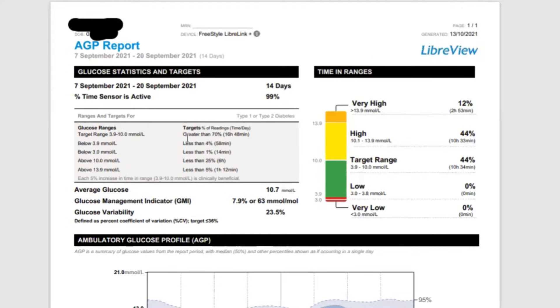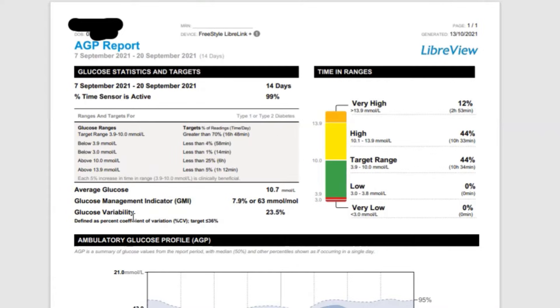We want to be in the target range 70% of the time or more. You can also see the targets for low blood sugars — below 70 mg/dL — and urgent low, which is 3 mmol/L equivalent to 55 mg/dL. Next, we look at the average glucose: 10.7 mmol/L, which is 193 mg/dL. Below that is the GMI — the Glucose Management Indicator — which is an estimated A1C based on sensor glucose. Here the GMI is expected to be 7.9%. The glucose variability is 23.5%, which is good; we generally want it below 36%.